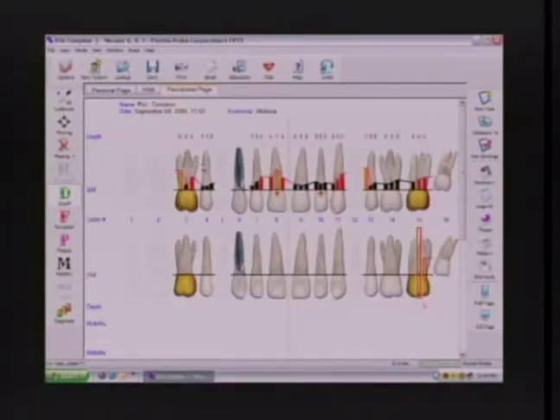But what could cause that? Remember, this is a 15-gram constant force probe. It stops at the resistance of 15 grams. So if there is subgingival calculus, if there's a crown margin or some other tooth anomaly that catches the tip of that probe, it's going to stop at that level. We need to make sure that we find the true bottom of the defect.